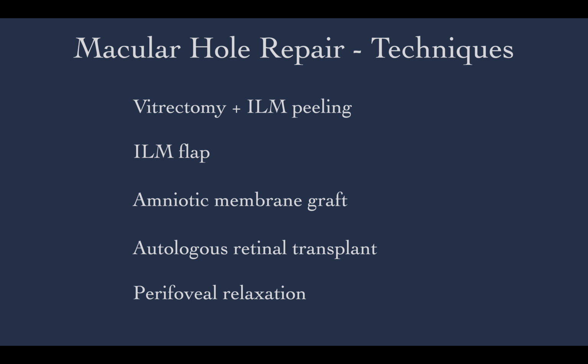Perifoveal relaxation, the final technique, means detaching the edge of the hole so that the hole may close. This effect may be created with massage of the edge of the hole. Another option is the injection of perifoveal subretinal fluid, or, if a graft is placed on or under the edges of the hole, detachment is achieved.